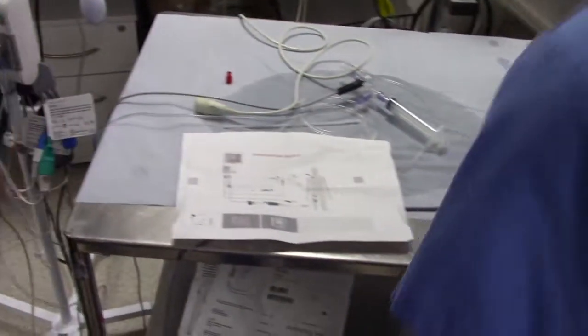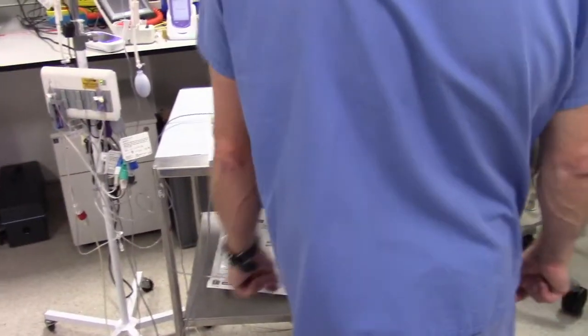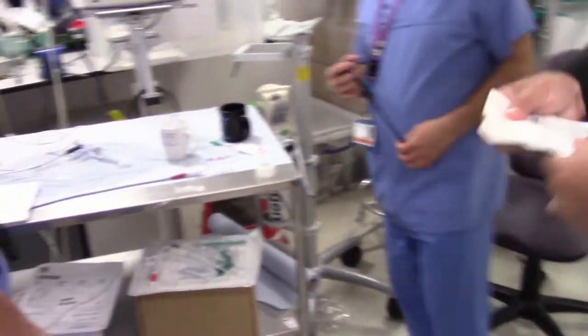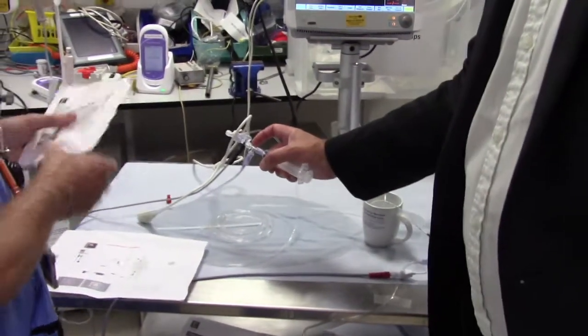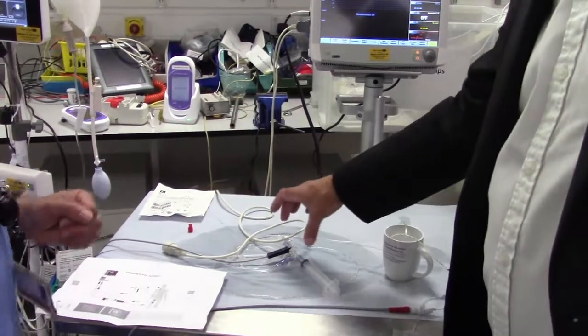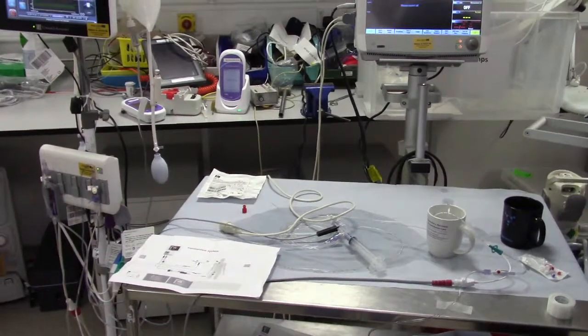No, to be quite honest, the rule of thumb with this, let me show you. Sorry, I brought some other things as well. These don't come with an extension piece. So that junction here, you can have this one. The injection manifold comes as a separate pack. So what do you get separately in the box when you get it out of the box? It comes with everything.